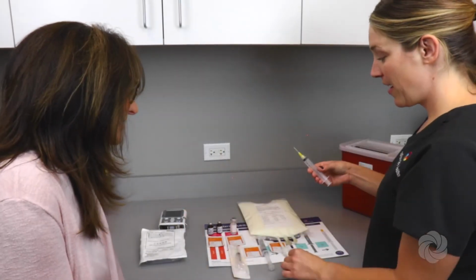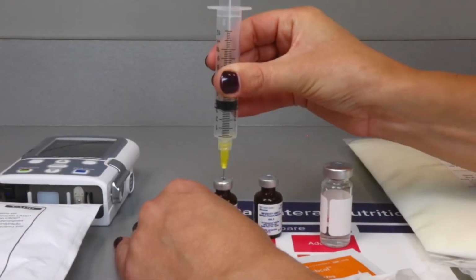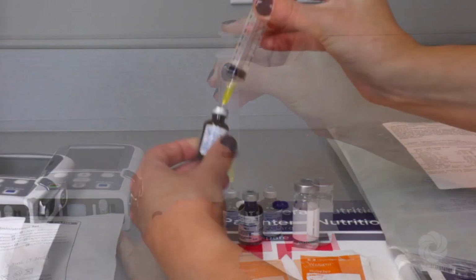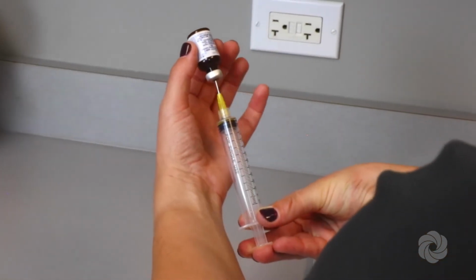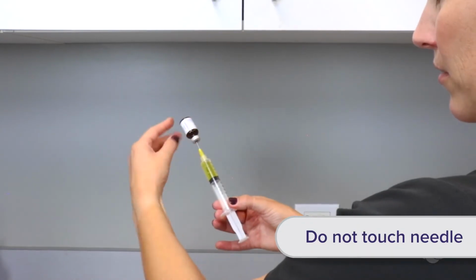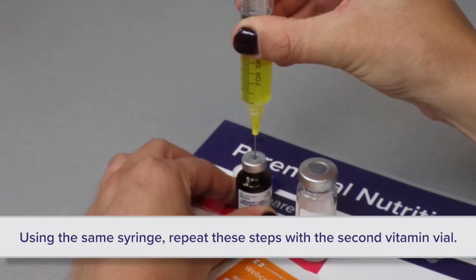Place the vial on a hard surface and insert the needle straight into the rubber stopper of the first vitamin vial. Slowly inject all of the air into the vial, making sure not to touch the needle tip to the solution inside the vial. Pick up the vitamin vial and turn upside down. Adjust the needle so the tip is in the fluid. Slowly withdraw all contents into the syringe. Be careful not to touch the needle when removing the vial. Using the same syringe, repeat these steps with the second vitamin vial.